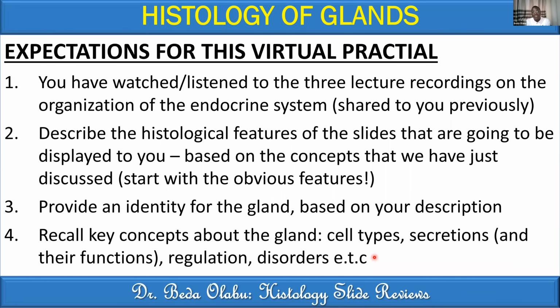Maybe the function, the parenchymal cell types, the hormones or the secretions that these cells release, and perhaps the functions of those secretions. You are expected to recall how that gland is regulated to perform its functions, and some of the disorders related to the function of that gland. I will not talk about number 4 because it's already captured in the theory lecture, but I expect you to recall that one.